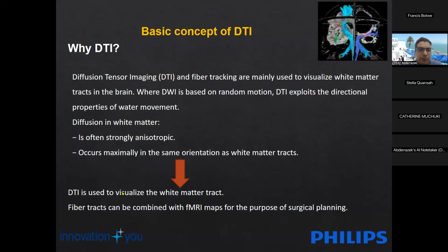Also, the fiber tract can be combined with, for example, functional MRI with BOLD contrast, which I'm talking about for some purpose like surgical planning.